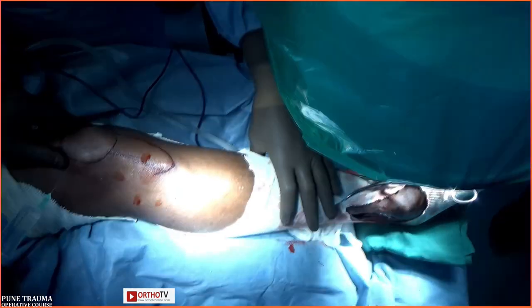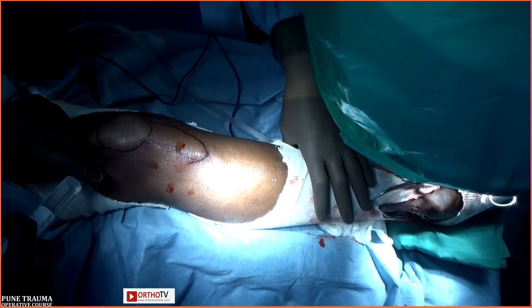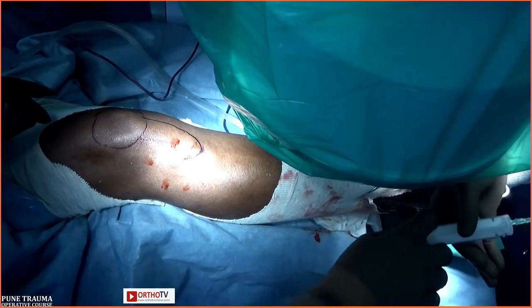Thanks Abhay. Gadegone sir, you are ready? Within 5 minutes, because that suprapatellar nail tray is coming within 5 minutes. So this infiltration is always mandatory for you? It is always better. It is not described, but I do it. I must see the ballottability of the patella. That is the most important thing, because otherwise what will happen? You will not be able to pass the sleeve underneath the patella. So you must see the ballottability.